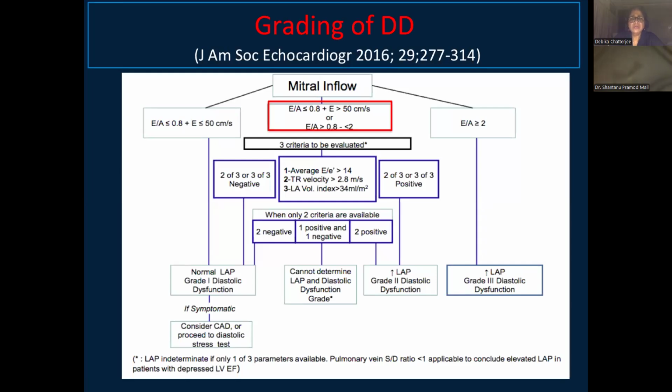And now let us look at the middle arm of the mitral inflow patterns. These are the patterns we get every day, in many cases, either these or that. So you have to know all these patterns. Depending on the diseased condition, the Doppler pattern of the mitral flow varies.